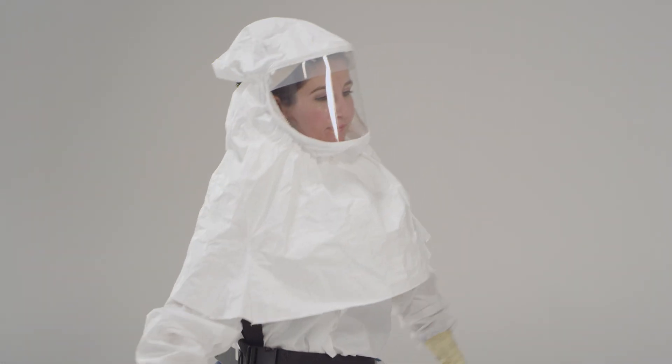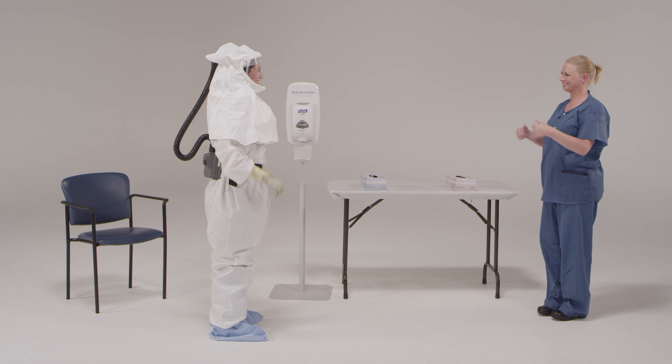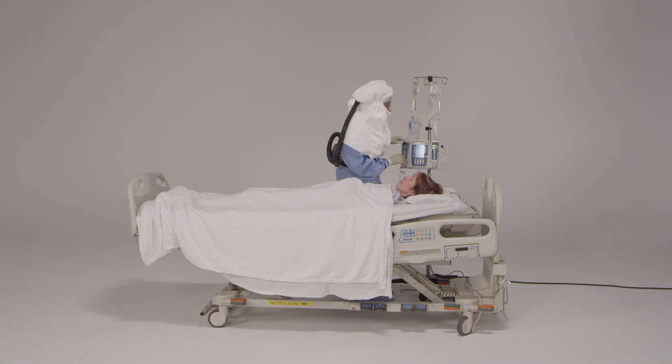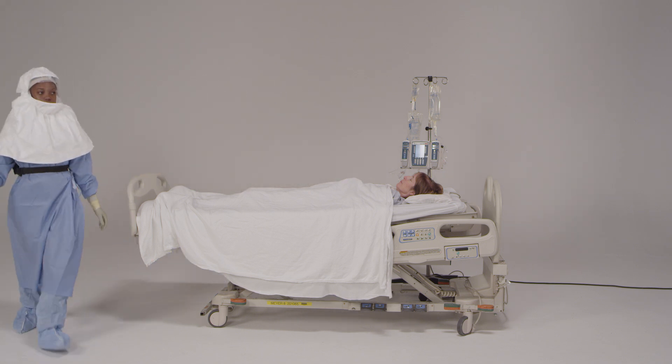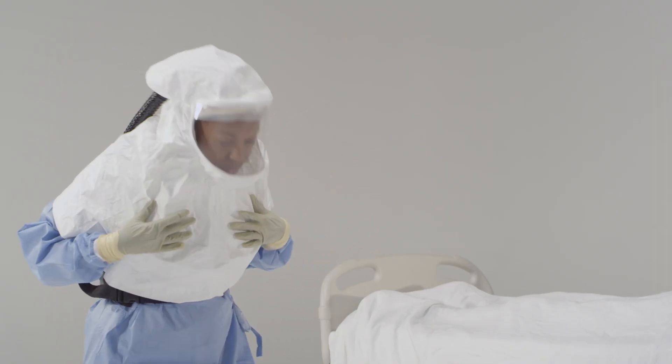Completion also means a thorough check to ensure no part of the personal protective equipment is ripped or torn. As an observer, you are guiding and protecting your colleagues. The foundation of your role is communication. The first step here is to agree on a system of engagement so that you and your health care provider colleague can signal one another that the donning and doffing process needs to begin.